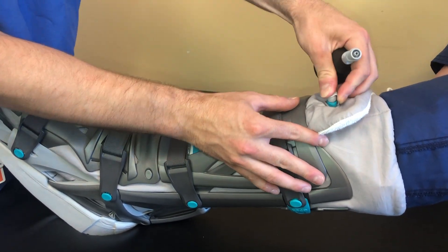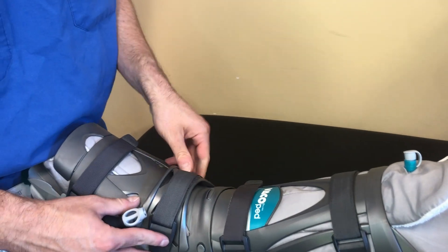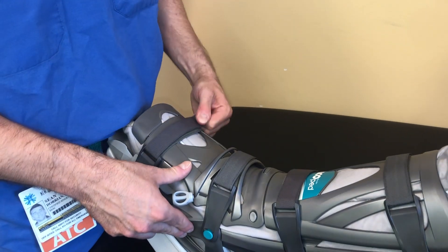Lastly, adjust the straps as needed by either tightening or loosening each strap. The straps closest to the ankle, numbers one and two, should be the most secure to ensure your ankle does not slide forward.